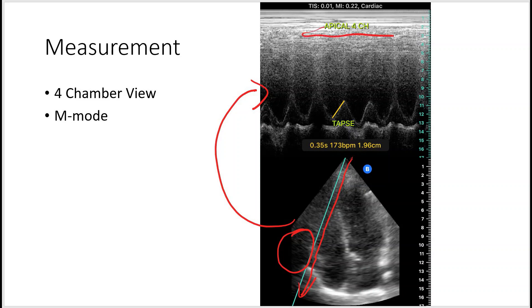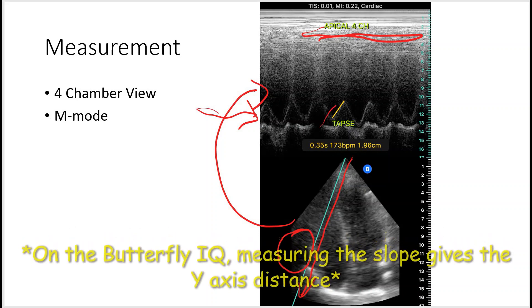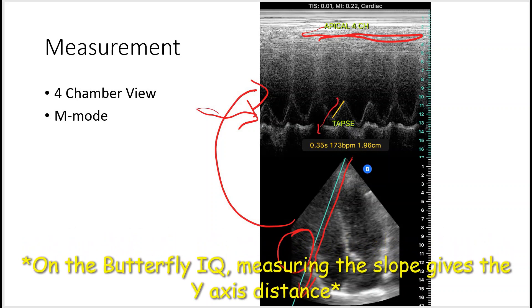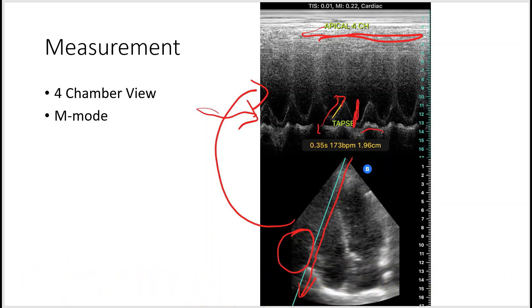So we have the apex up here, and these are the shortening of the tricuspid annulus when the heart contracts. You can measure the slope of the trough to peak, and this will give you the vertical distance. This heart measures 1.96 centimeters. I also want to point out that from here to here is when the heart is in systole.